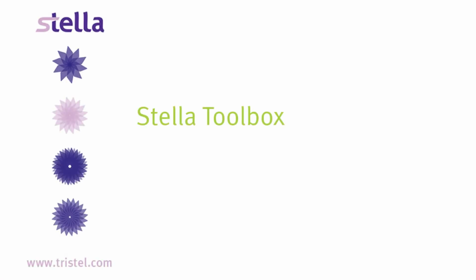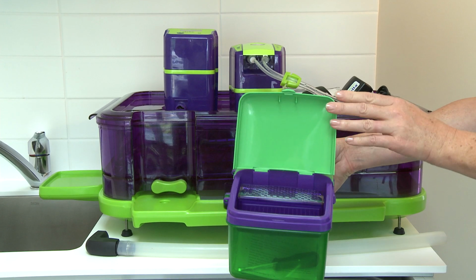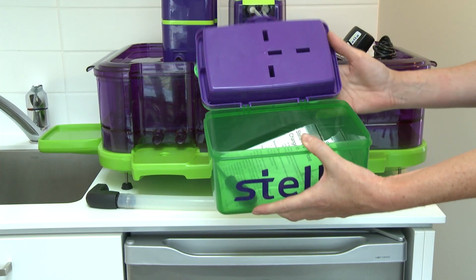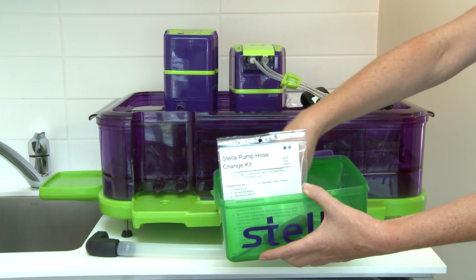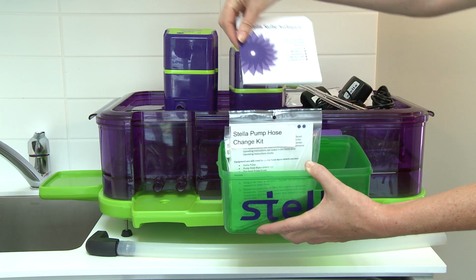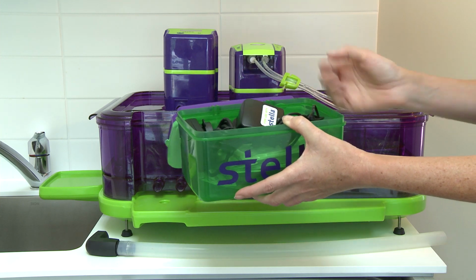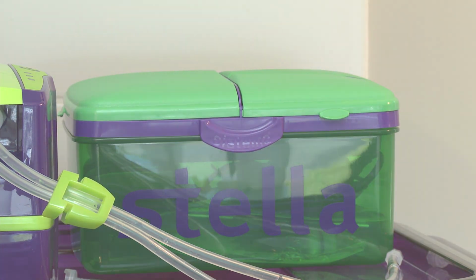Stella Toolbox. The Stella Toolbox stores Stella accessories when not in use. The small parts tray, lube, grommets, and drainage outlet cap can be placed in the lid compartments. The toolbox also includes 2 help kits: Stella Pulse Pump Hose Change Kit and Stella Manual Emergency Kit Process, and a software keycard included for installing Stella Suite. The dual Luer lock connector, Surrogate Lumen, and the power adapter can be stored inside the toolbox. These items will be covered in detail later in this training.